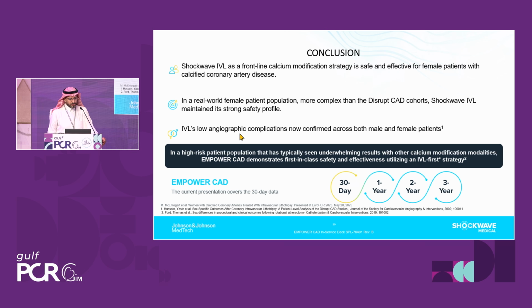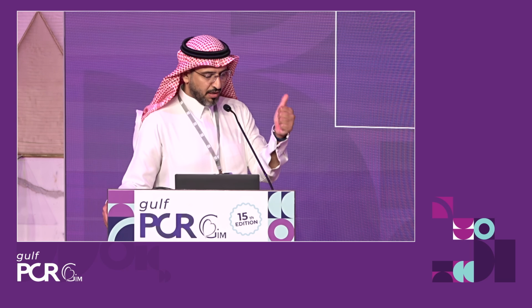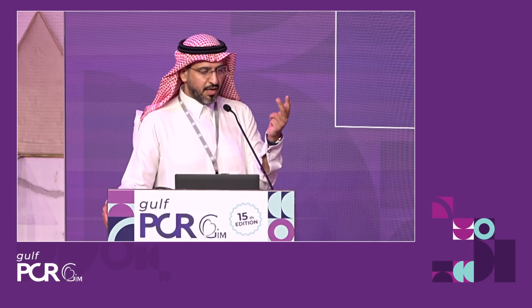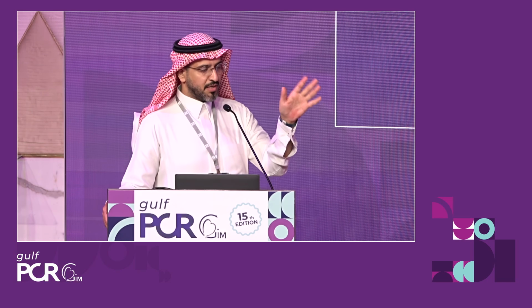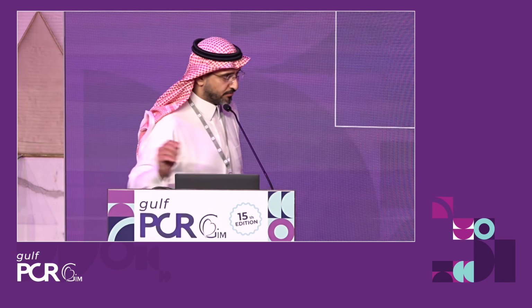Low angiographic complications were confirmed across both male and female patients. So by this, I can assure, by the three trials, that IVL is effective, safe, and also has the best calcium modification without medial disruption. And thank you very much.